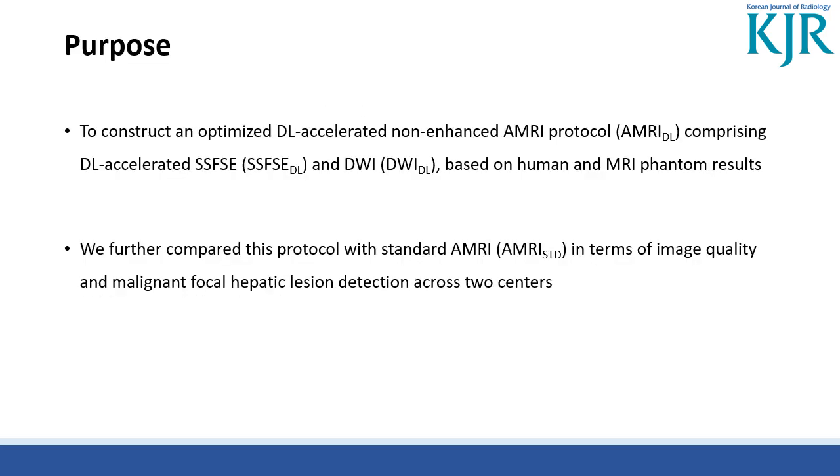The purpose of our study was to construct an optimized deep learning accelerated non-enhanced AMRI protocol comprising DL accelerated SSFSE and DWI based on human and MRI phantom results. We further compared this protocol with standard AMRI in terms of image quality and malignant focal hepatic lesion detection across two centers.